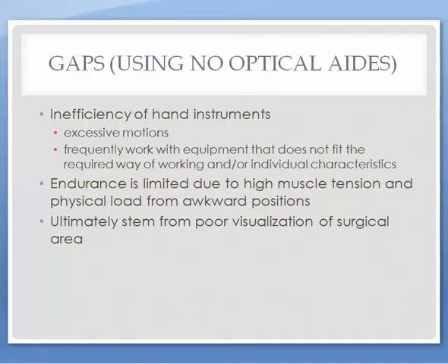Prior to optical aid advances, endodontists only had their eyes. Notable gaps were inefficiency in handling the instrument due to excessive motions and using tools for unintended purposes. Furthermore, high muscle tension and physical load was the result of having to use the tools in awkward positions for prolonged periods of time. Ultimately, these gaps are a result of the overarching poor visualization of the surgical area.